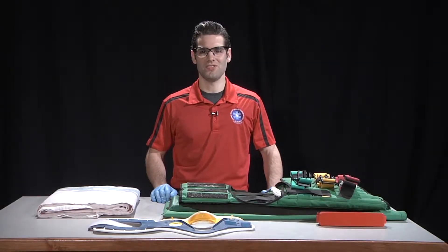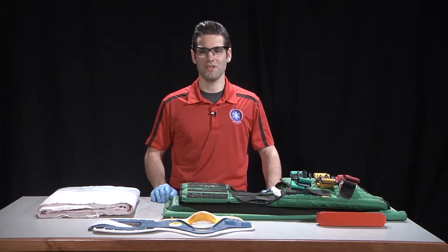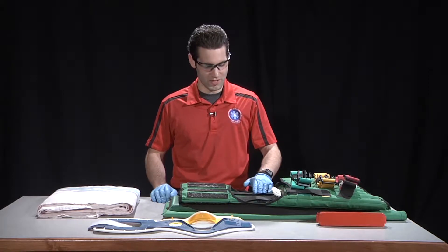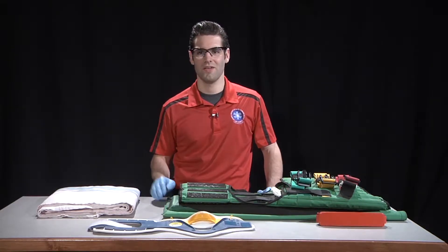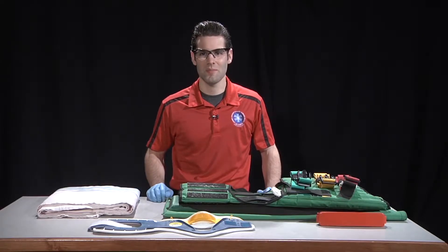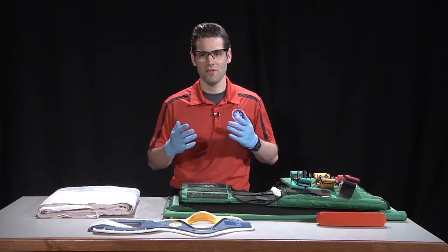This is the Seated Spinal Immobilization Skill. The equipment we'll need for this skill is a short spinal immobilization device with straps, a C-collar, and padding material. The recommended PPE for this skill are gloves and eye protection.